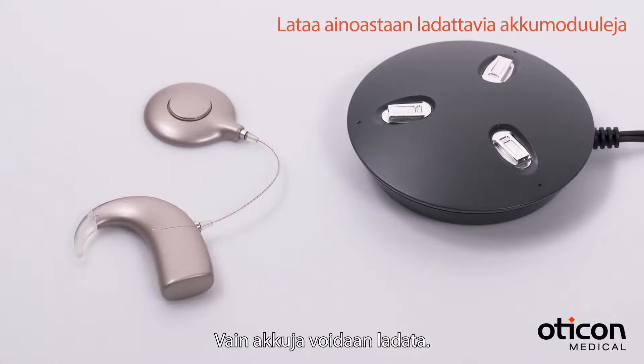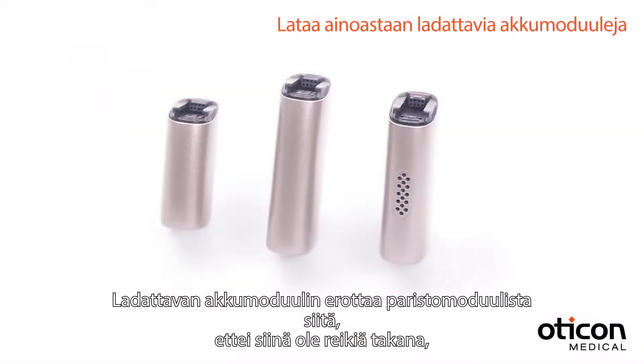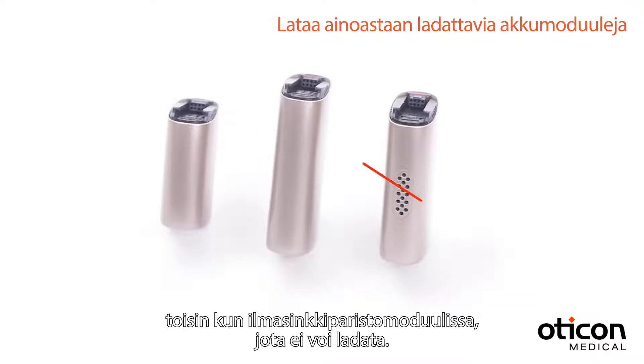You can only charge rechargeable battery modules. You can see if you have a rechargeable battery module because it has no holes on the back, unlike the ZincAir battery cartridge, which cannot be recharged.